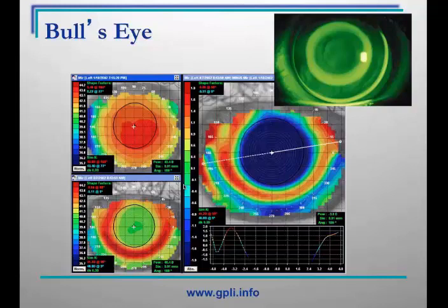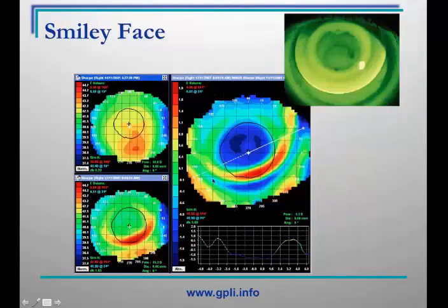What you want to achieve is a bullseye corneal topography pattern. A bullseye topography map indicates that the treatment is progressing properly. The treatment zone is centered properly over the central cornea, and the area of flattening noted here, the blue area centrally, I can show it to you, right in there, is right over the pupil, so we're flattening the area that we want to flatten, and then you'll have paracentral steepening.